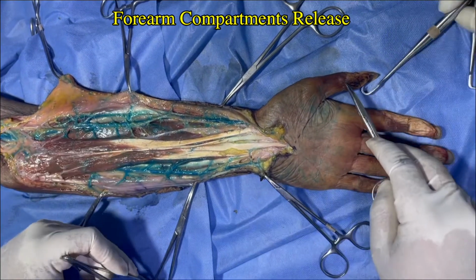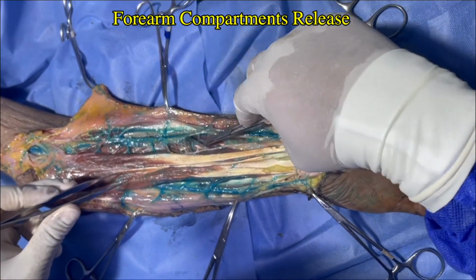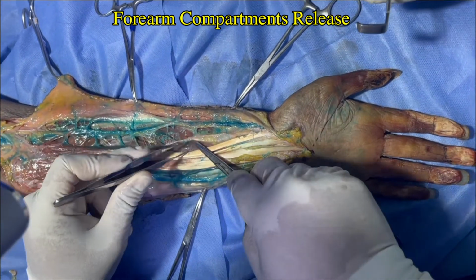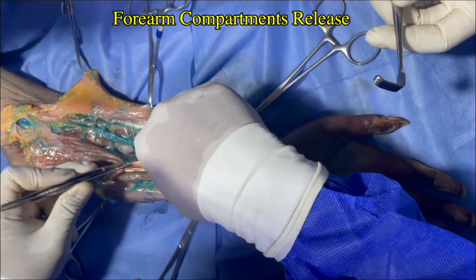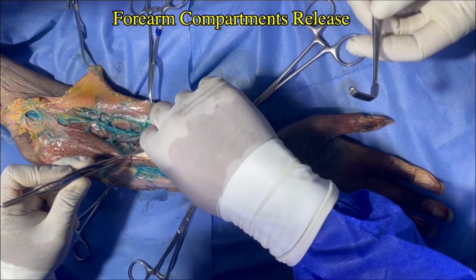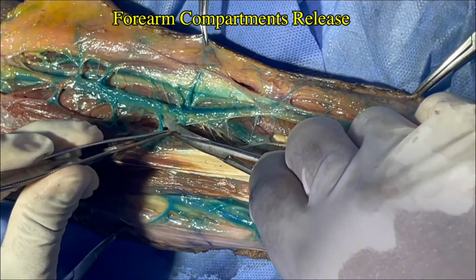Then we proceed to the release of the deep flexors, also with blunt dissection, on the radial border of the superficial flexors, respecting the perforators of the radial artery that are directed mainly to the muscle bellies and performing the respective fasciotomies and fasciectomies. And we proceed in a similar way in the ulnar border of the superficial flexors.